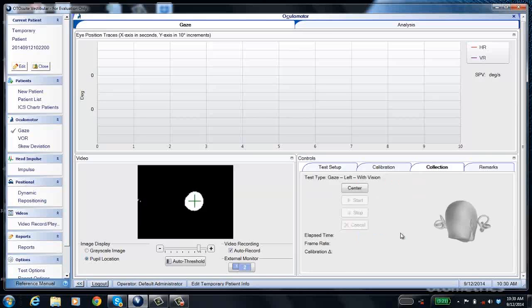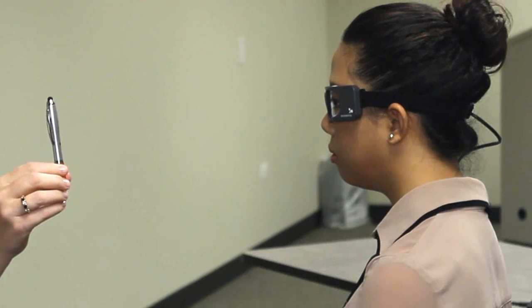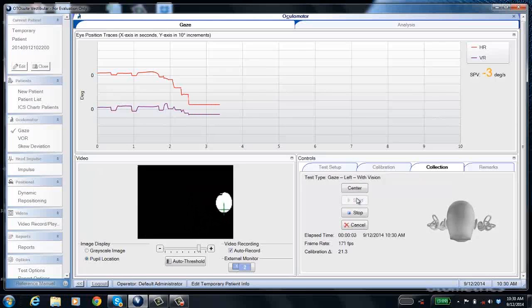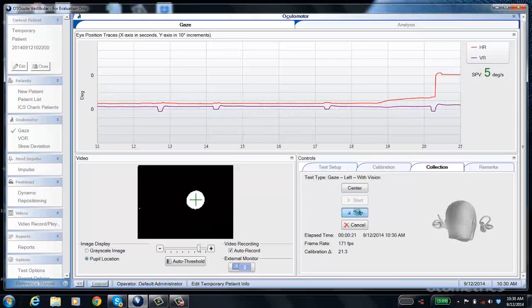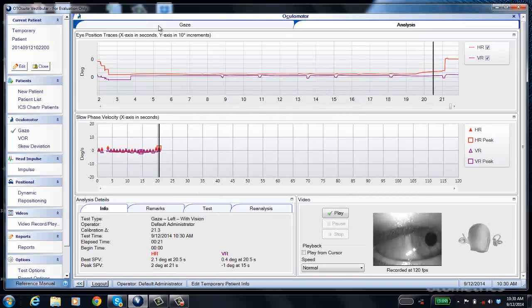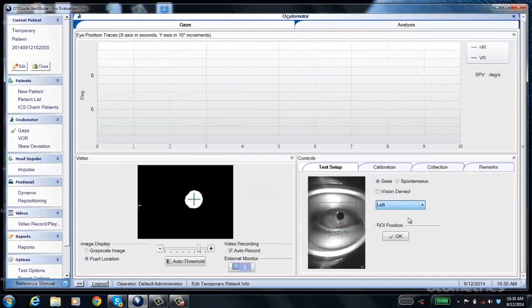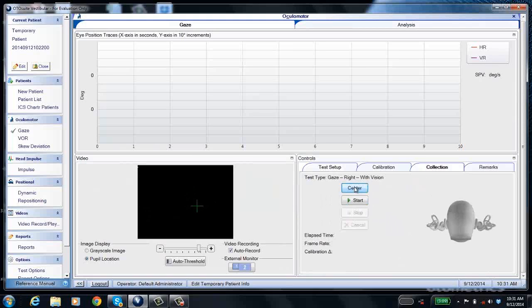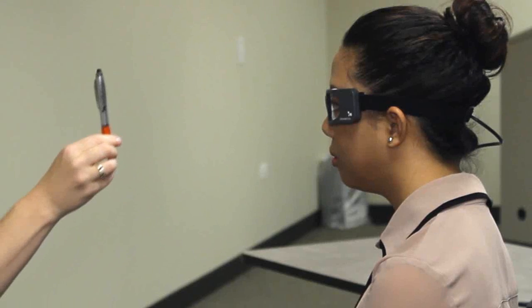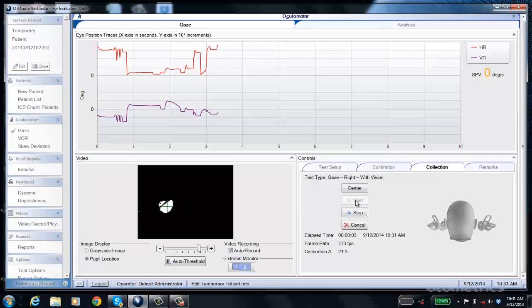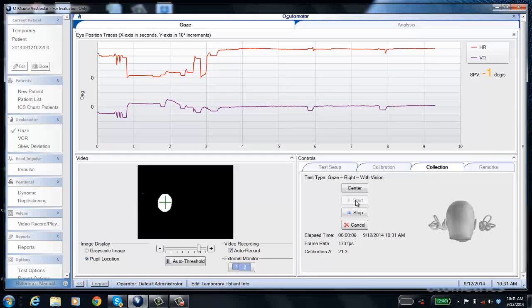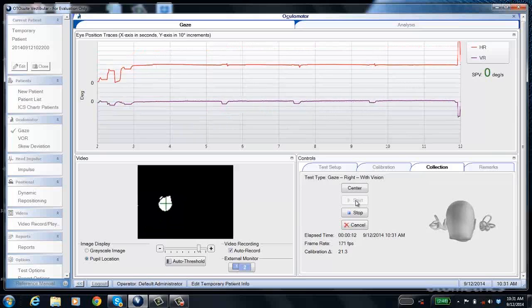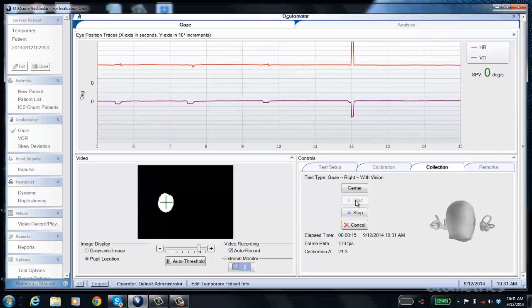First, we're going to ask the patient to look left. Since this patient is within normal limits, we don't see much in the trace — it's pretty much a flat line. Once done collecting, click stop. Then choose the next position — right — and ask the patient to look right. Again, no nystagmus, a fairly flat trace. You could set the test to only run 10 to 20 seconds and have it automatically stop for you.